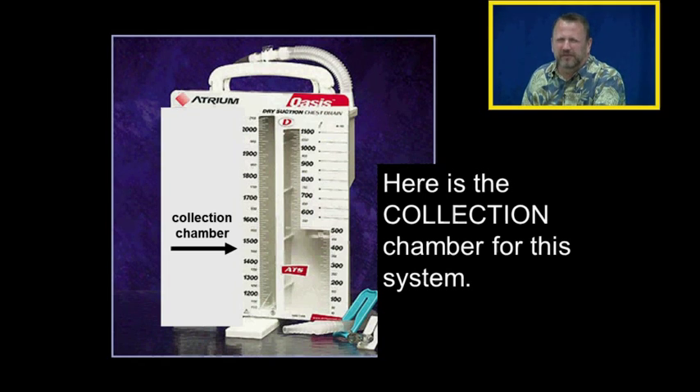Everything else is exactly the same. Here's the collection chamber for this system. The collection chamber collects the fluid and is graduated, so it's easy to measure how much fluid has come out over an amount of time. We can also see the color of the fluid through the window — so that's no different.